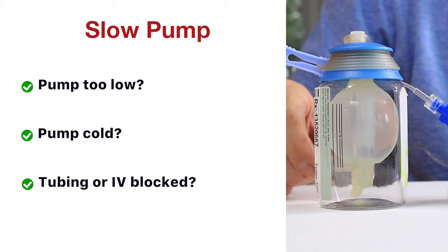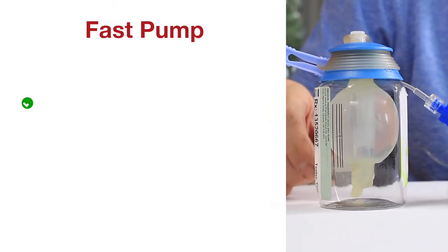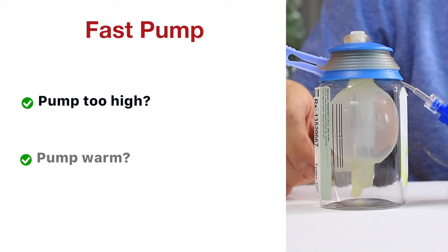Now, what about if the balloon emptied too soon so the pump ran faster? Maybe it was placed too high above the arm so it ran faster. Or was the pump sitting in the sun exposed to heat? That can cause it to run faster as well.